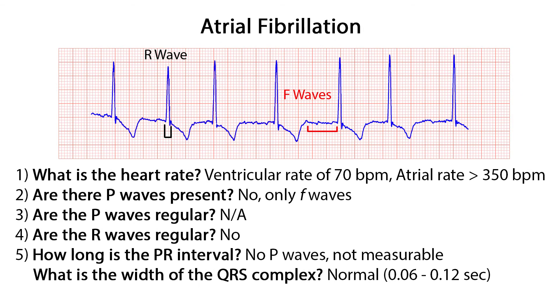Now we'll use the 5-step approach to evaluate atrial fibrillation. Step 1: What is the heart rate? Counting the R waves, or QRS complexes, in 6 seconds, there are 7 — so 7 times 10 equals a ventricular rate of 70 beats per minute. Step 2: Are there P waves present? No, only fibrillatory f waves. The atrial rate is impossible to determine but is very fast, most certainly greater than 350 beats per minute. Step 3: Are the P waves regular? There are no P waves, so this doesn't apply. Step 4: Are the R waves regular? The QRS complexes, or R waves, occur at irregular intervals. Step 5: How long is the PR interval? Since there are no P waves, it is not measurable. What is the width of the QRS complex? They are all normal, falling between 0.06 to 0.12 seconds.